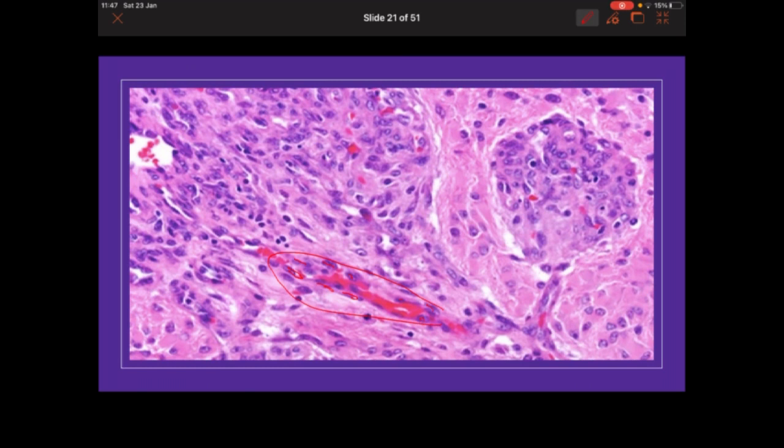But in the blood vessel that exhibits glomerular or microvascular endothelial proliferation, the endothelium that lines these blood vessels proliferates. They cause multiple layers, not monolayered like these blood vessels. And all these endothelial cells occupy the lumen, leaving only these small spaces in between. This is what we call microvascular proliferation.